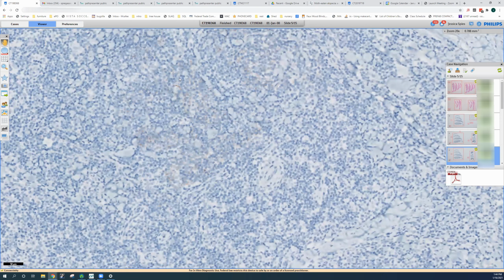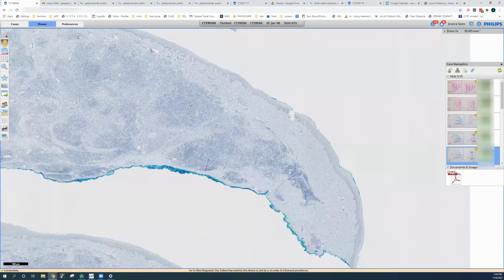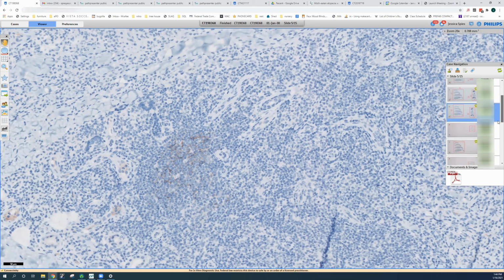And it highlights that there are some follicular dendritic cells in these nodules. So these are kind of blown apart follicles, not normal follicles. Here we go, some more here. This is from the colonization of the follicles by the neoplastic B cells.